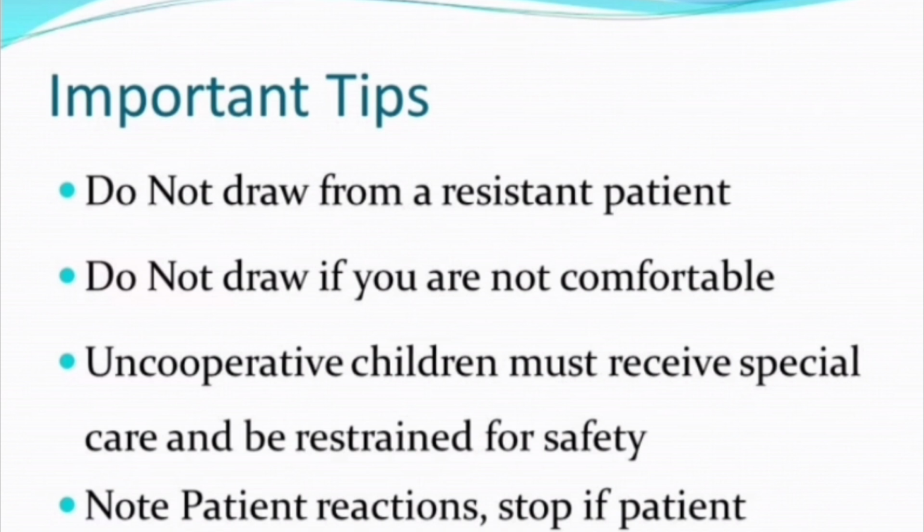Important tips. Do not draw from a resistant patient. Do not draw if you are not comfortable. Uncooperative children must receive special care and be restrained for safety. Note the patient's reactions. Stop if the patient complains of pain. Assess the patient.